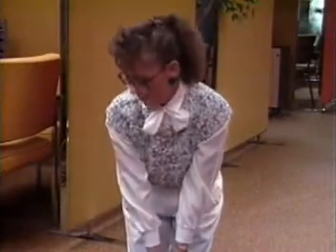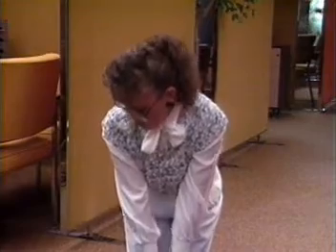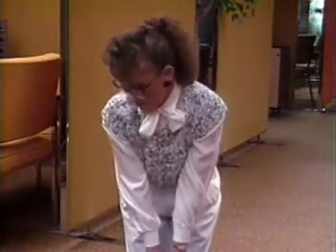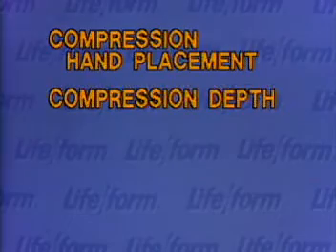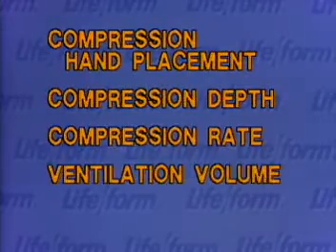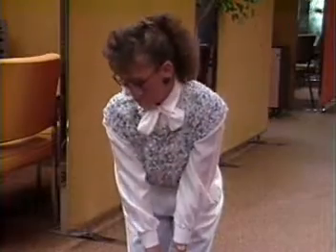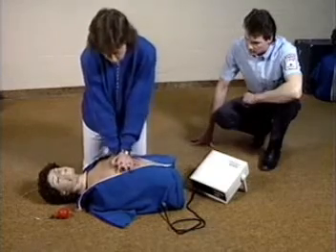Based on years of clinical and classroom experience, the American Heart Association has established standards and teaching guidelines that identify single therapeutic procedures for teaching CPR skills. Proper hand placement, compression depth, rate of compressions, volume of ventilations, and duration of ventilations are the essential skills needed for successful CPR. For the CPR student, technique is acquired through practice.